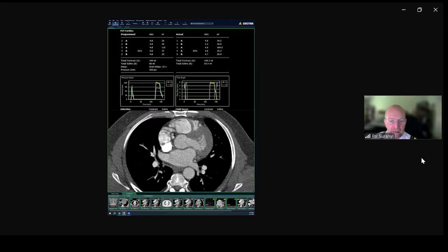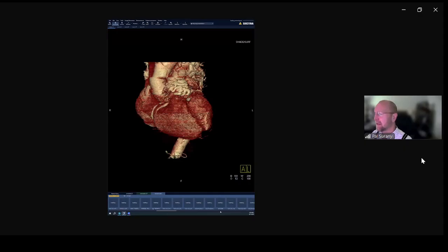All right. I have one more case. I know our time is going short, but it's interesting. So I'll be in a hurry with this one. I'm going to go a little bit faster, but this is just interesting because originally this case was noted first on cardiac MRI. The finding. This is actually an 80-some-year-old patient, a very older patient, and we noticed.